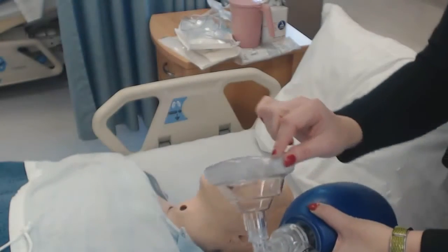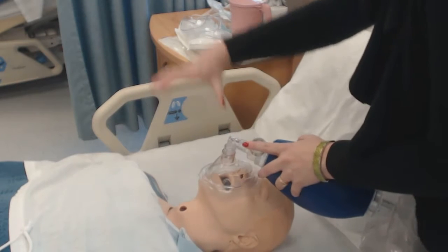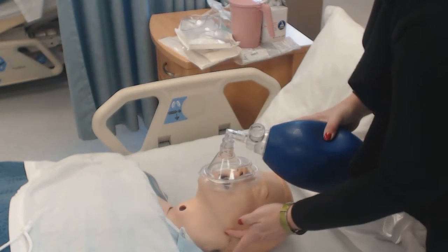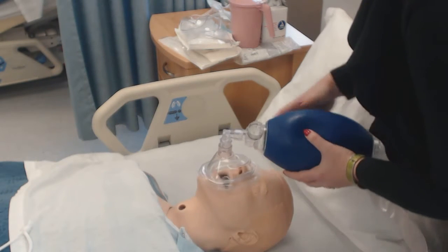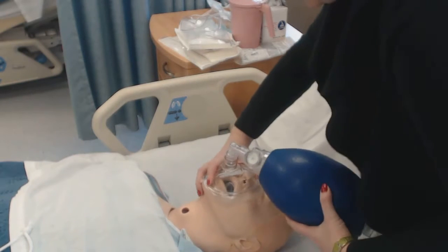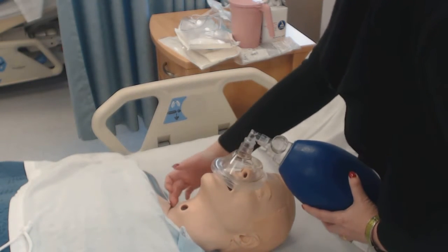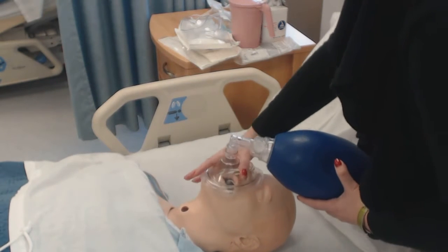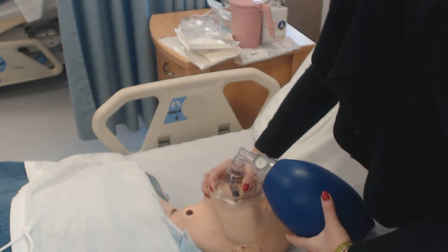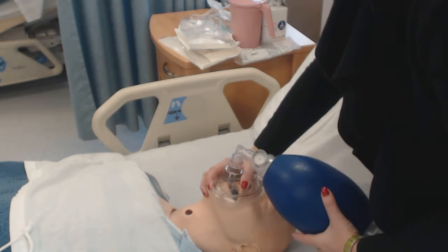All the way open — the mask goes on so the pointy end is over the nose. If I'm doing this myself I'm going to use a C-grip; if I need to, I use an E-grip, placing the pinky behind the mandibular notch and pulling the jaw forward. If someone else is bagging, this is my hand positioning — I dig fingers in underneath the jawline, pull the jaw up so the airway is as open as possible. With each respiration I should see chest rise.